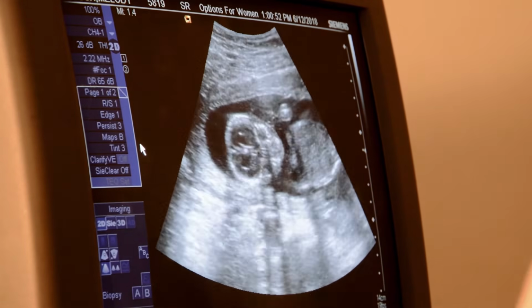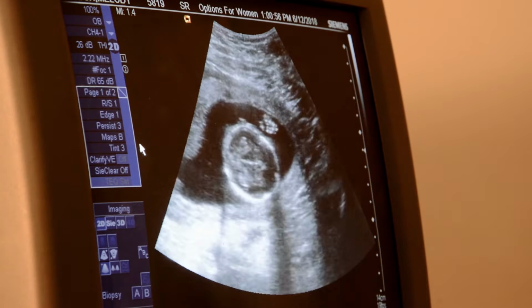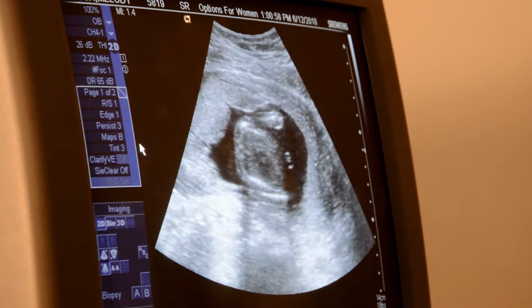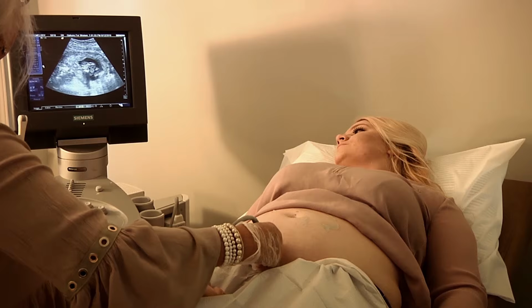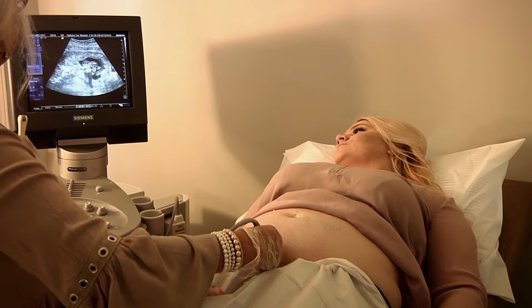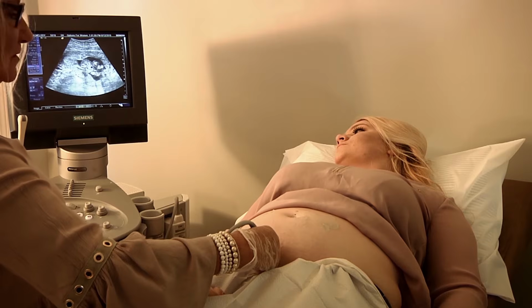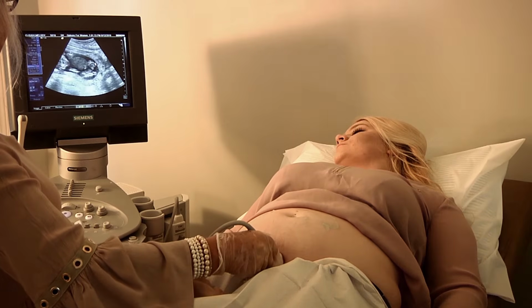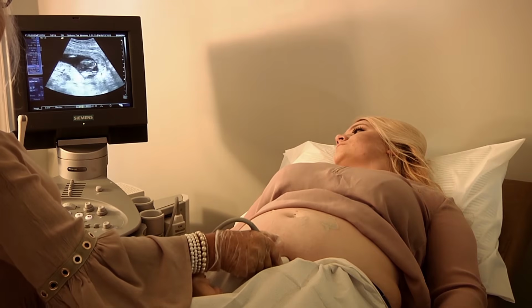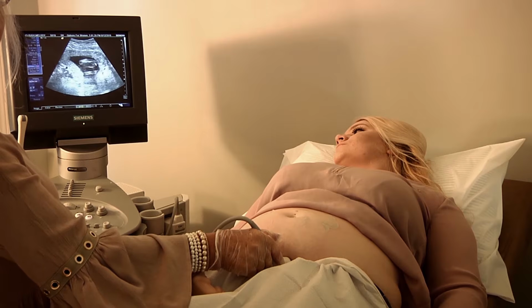And then we'll go to 2D. Okay. So now we're going to, here's the lie of the baby. We're going to go back to head, down the road of the baby. We got our heart. And now we're going down to the femur. So right here is the pelvis, and here's the femur bone. But we got to stretch it out. So watch me as I turn and rock.